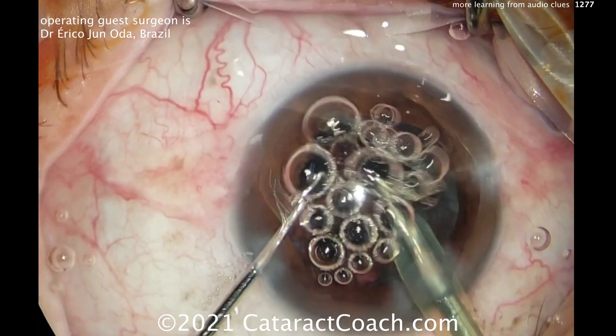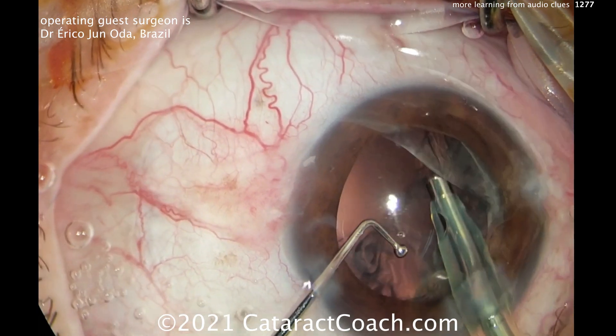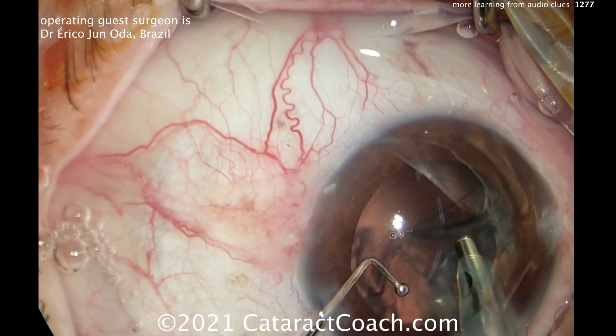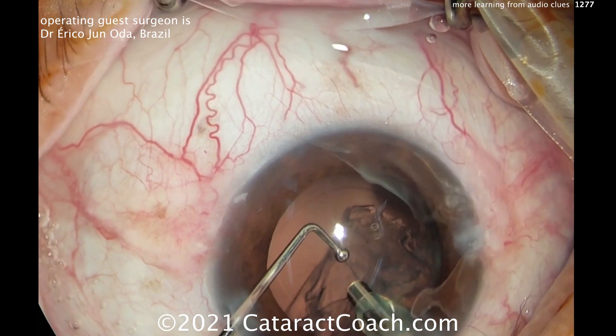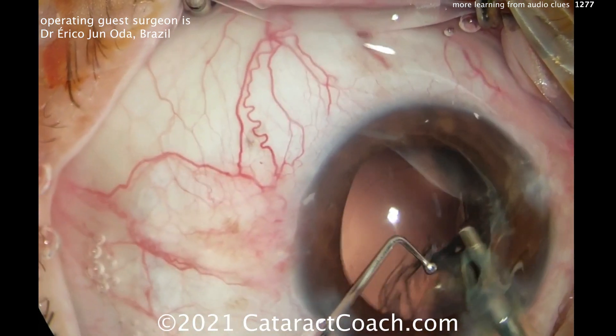Like the way you drive a car in a parking lot — if you're driving slowly, you give a tiny bit of pressure on the accelerator pedal to go slowly, and if you want to go a little faster, give a little more. But you don't come on and off the pedal repeatedly. That doesn't make a lot of sense. One of the mistakes a novice surgeon will make is coming on and off the pedal.